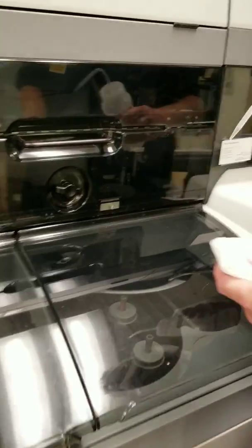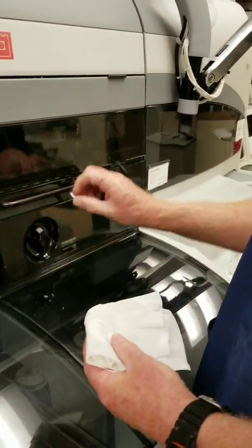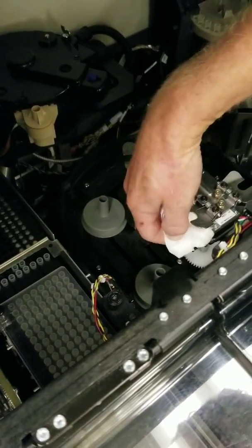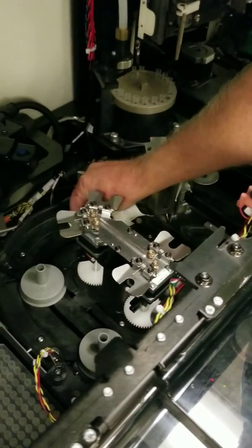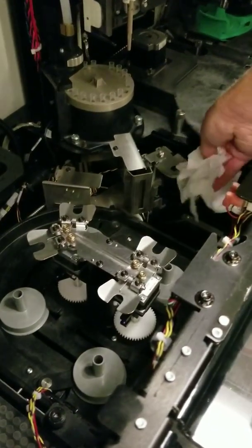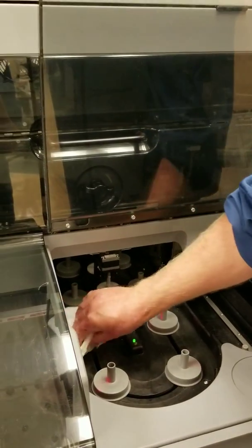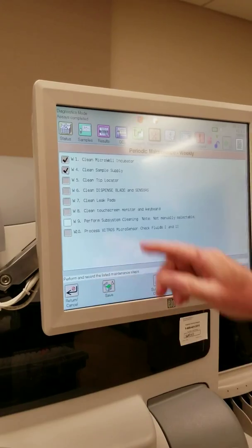We'll come back and check off the micro-well incubator, then go down to the sample supply. Next, we're cleaning the sample supply. We lift the middle hood and use a wet lint-free cloth to wipe down the sample tray and the retainer clips — make sure you get the top and the bottom. Then we're wiping down the sample tray. Don't forget to wipe down the stat lane. The front cover gets lifted and we finish wiping down the sample tray. We check off our clean sample supply.